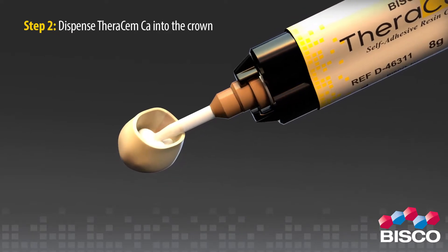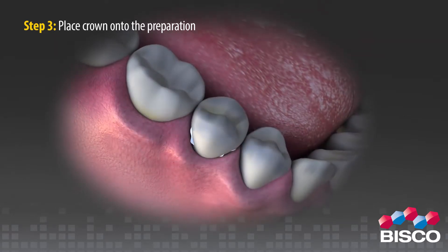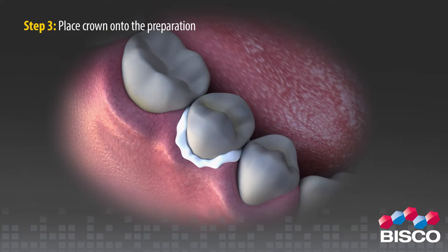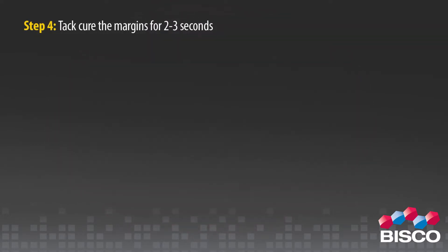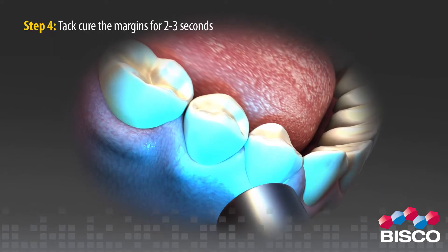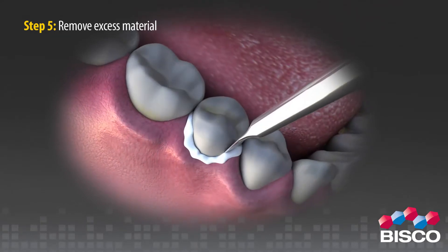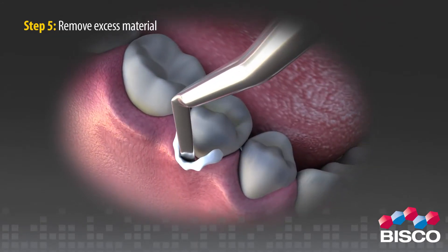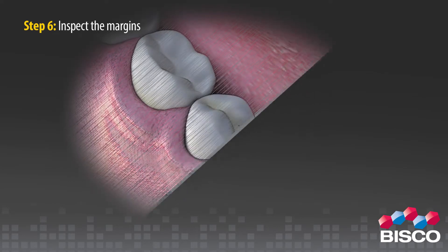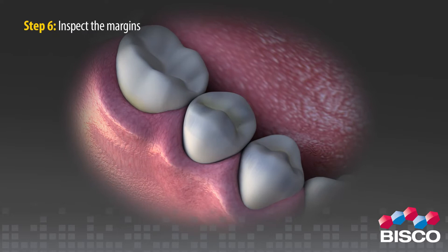Step 3: place the crown onto the preparation. Step 4: tack cure the margins for 2 to 3 seconds. Step 5: remove excess material. Step 6: light cure for 20 to 30 seconds, or allow to self-cure.